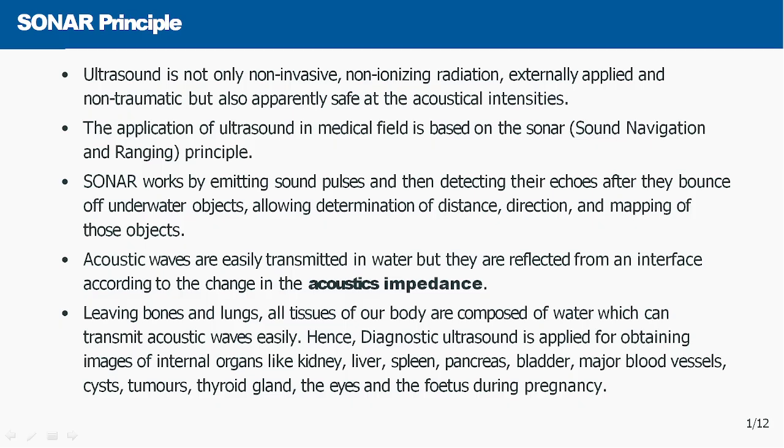Acoustic waves are easily transmitted in water, but they are reflected from an interface according to the change in their acoustic impedances. We all know what impedance is. Acoustic impedance is the hindrance shown by a particular medium or any obstacle. So that is called the acoustic impedance of that obstacle or medium.